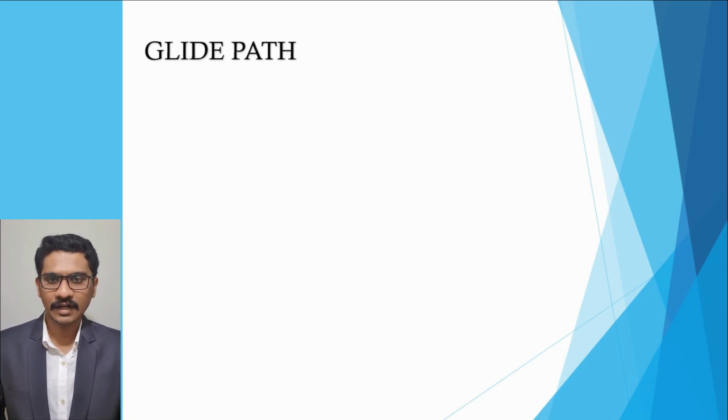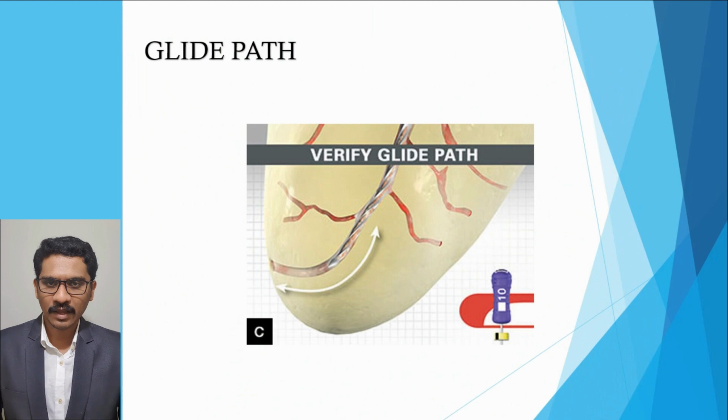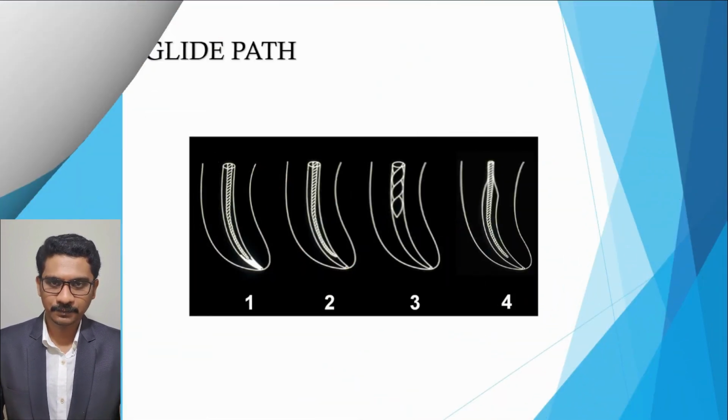One guiding strategy that has emerged as a critical part of endodontic success is the creation and maintenance of a glide path. A glide path is defined as a smooth, though possibly narrow, tunnel or passage from the coronal orifice of the canal to the radiographic terminus or electronically determined portal of exit. Its minimum size is a super loose number 10 endodontic file. The glide path must be discovered if already present in the endodontic anatomy or prepared if it is not present. The glide path can be short or long, narrow or wide, essentially straight or curved.